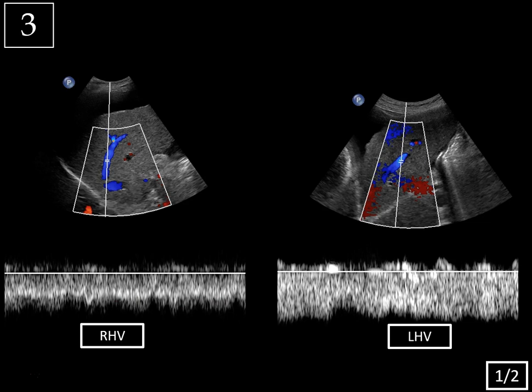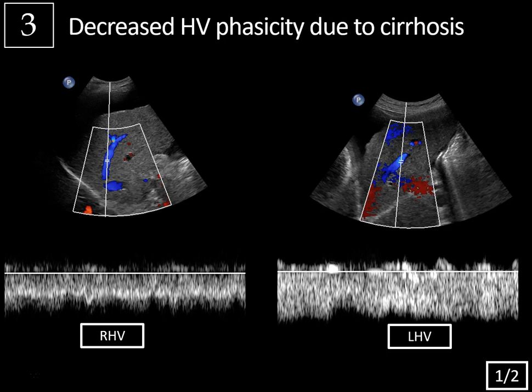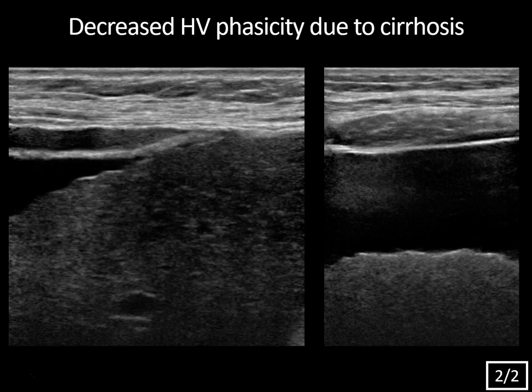What's causing that? Even on these images you can see nodularity to the hepatic contour as well as some ascites. This is decreased hepatic vein phasicity due to cirrhosis. Cirrhosis can compress the hepatic veins and cause this decrease in normal phasicity. It also causes spectral broadening — that fuzziness between individual waveforms — which can be caused by cirrhosis, but also by anything causing hepatic venous outflow obstruction, hepatic vein thrombosis, or Budd-Chiari syndrome. Switching to the linear array probe gives much better resolution, allowing you to see the nodularity of the hepatic contour, ascites, and the heterogeneous echo texture of the hepatic parenchyma typical for cirrhosis.